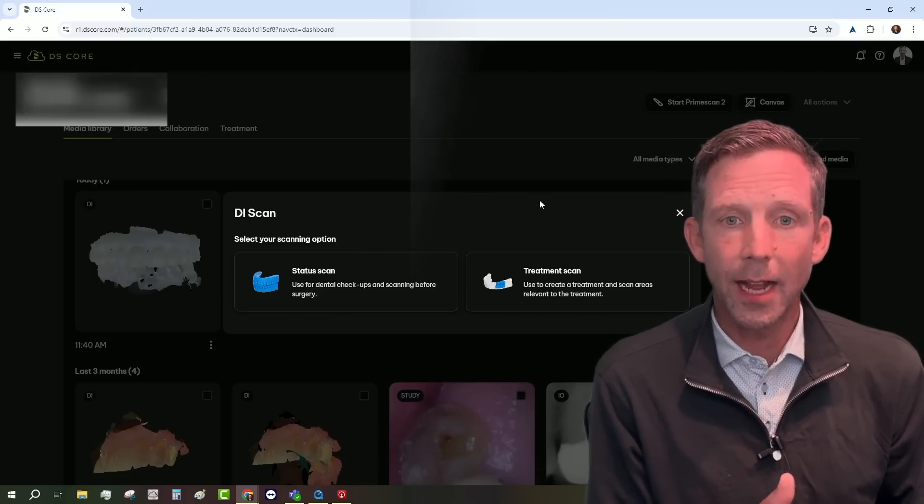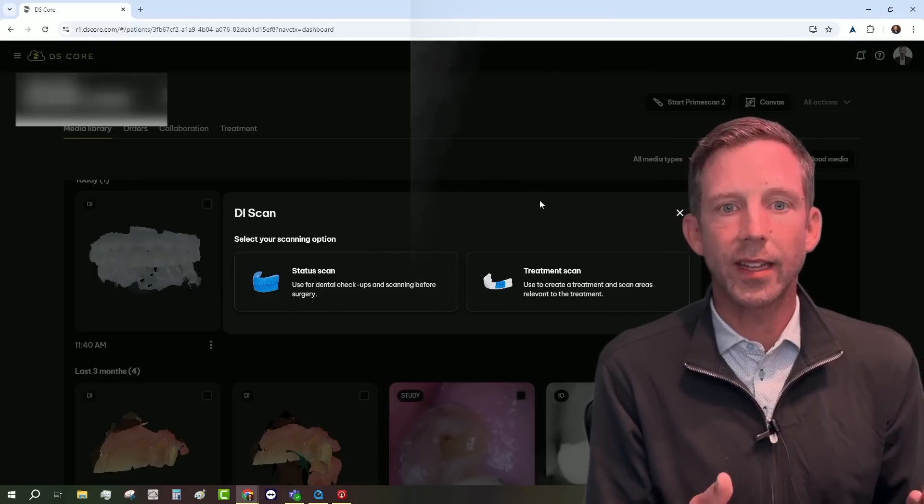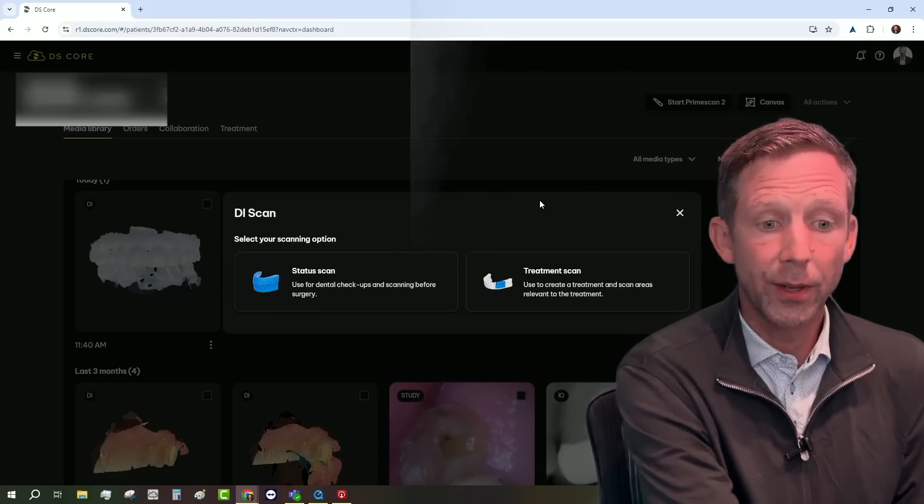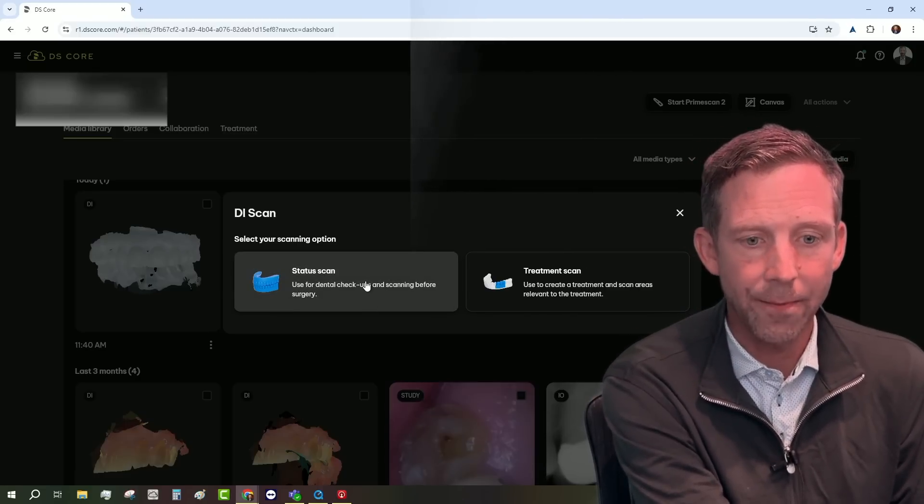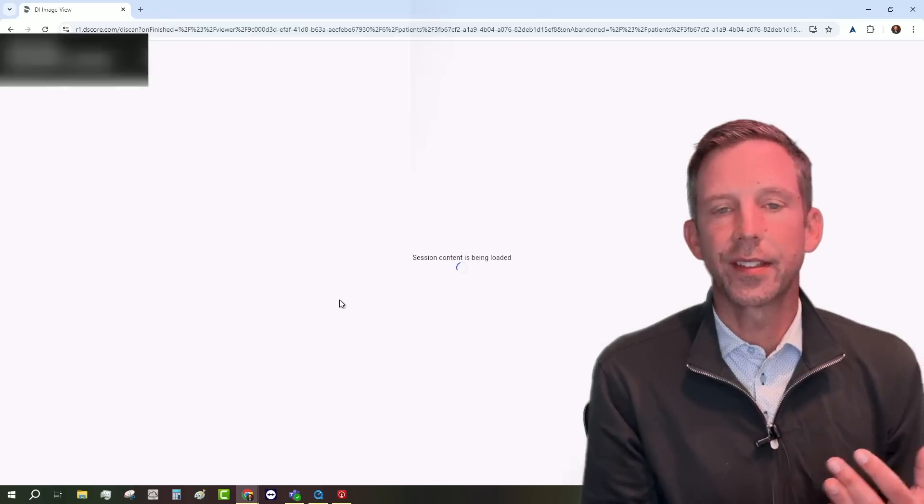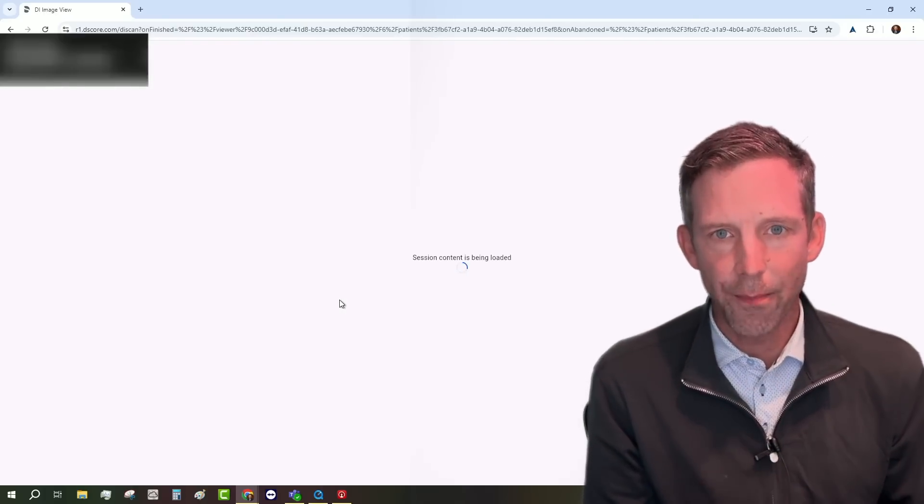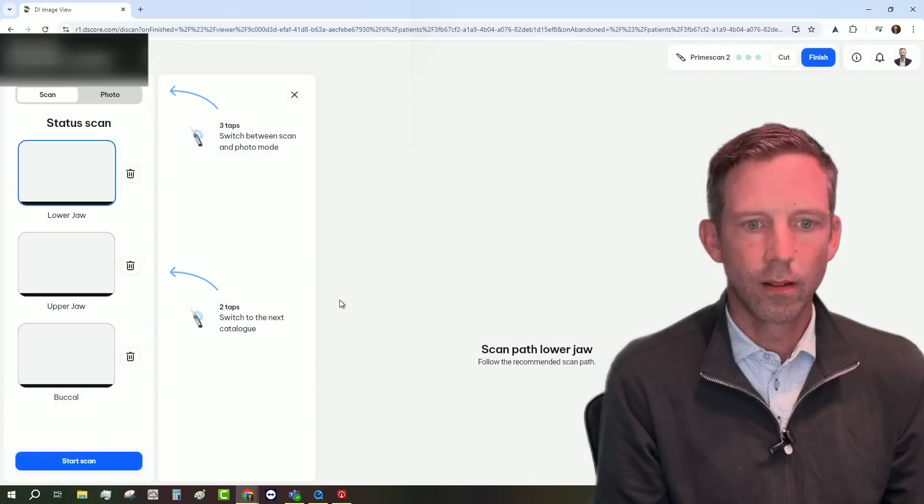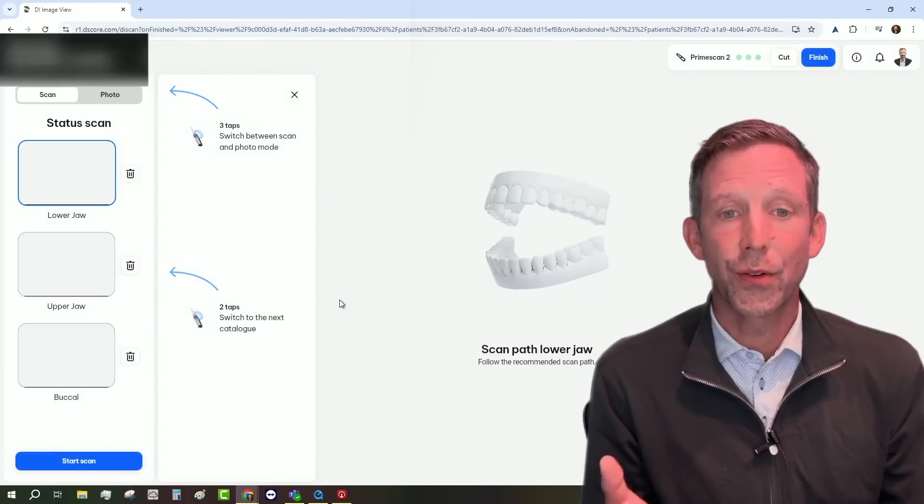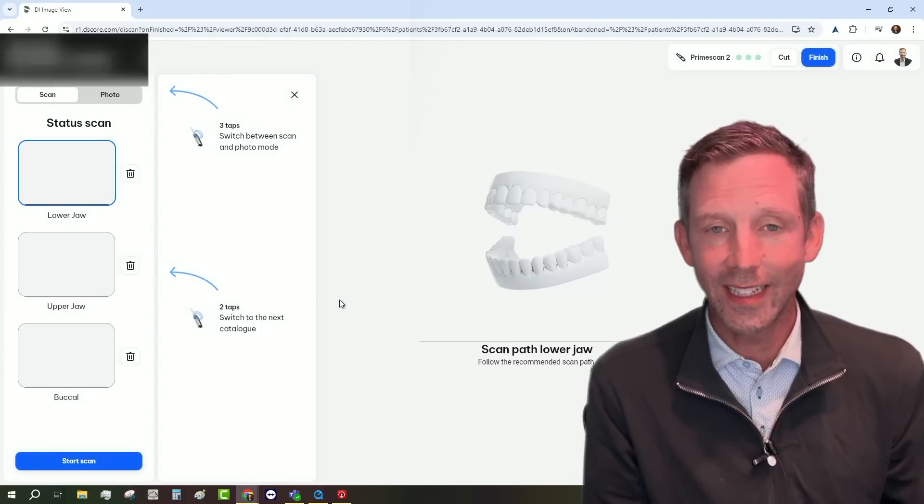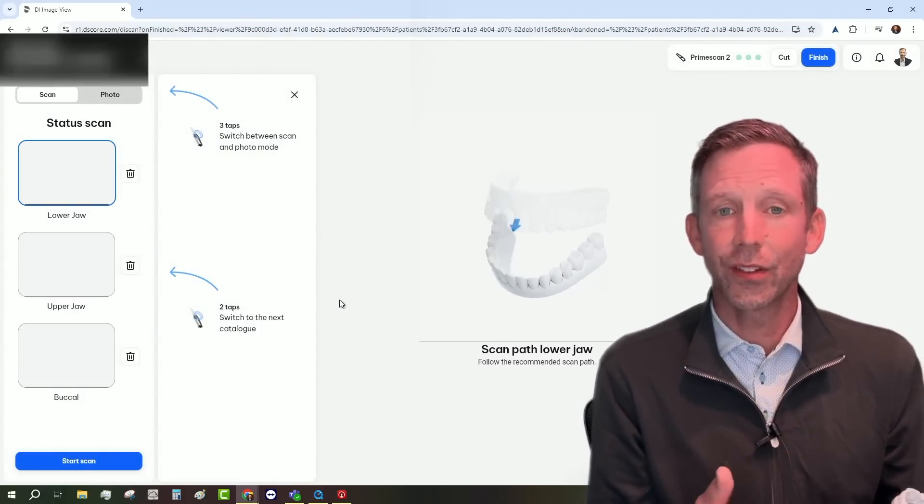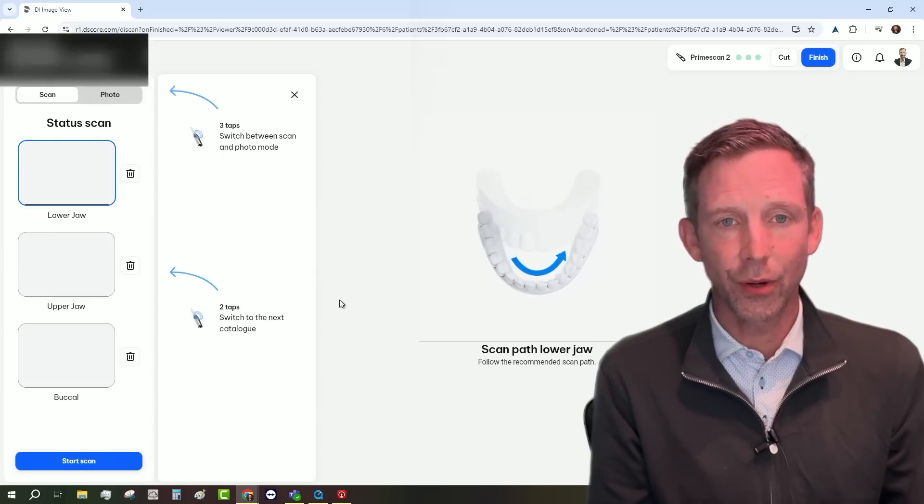But for this particular example, let's just do a very quick quadrant scan on a model. So I'm gonna go ahead and select status scan. And when I do that, the scanning window is going to automatically open. So now I'm ready to scan directly into the cloud. And like I said, this can be on any computer in your operatory. It doesn't matter.